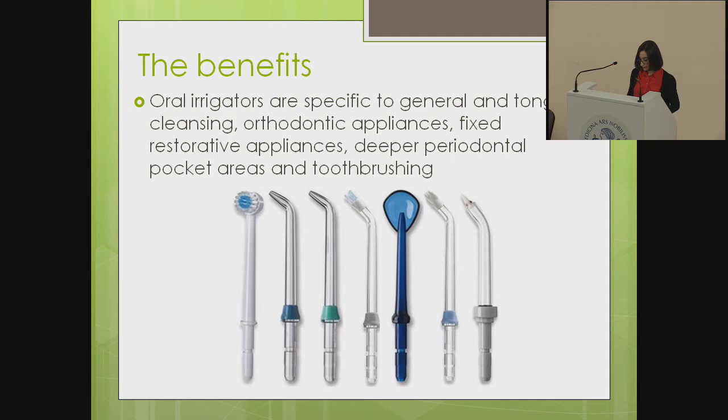So, according to benefits, in addition to subgingival lavage with water, the water flosser can also hold, deliver, and direct antimicrobial solutions into the sulcus and interproximal regions. Thus, when patients are advised to use antimicrobial agents for home care, the water flosser may be the best solution.